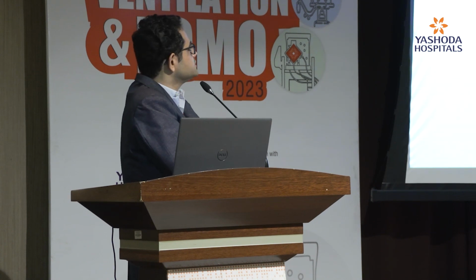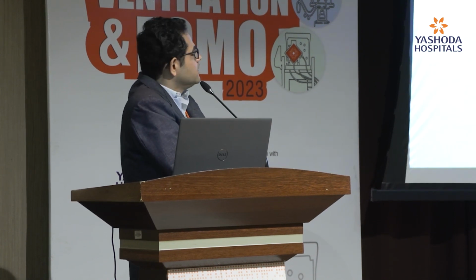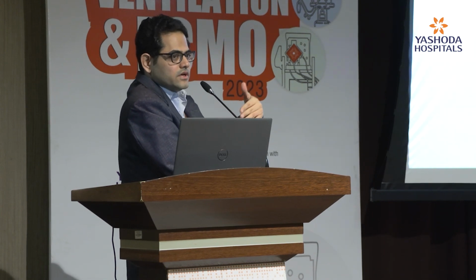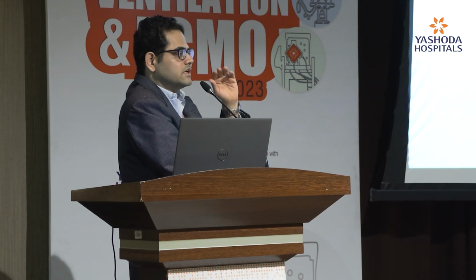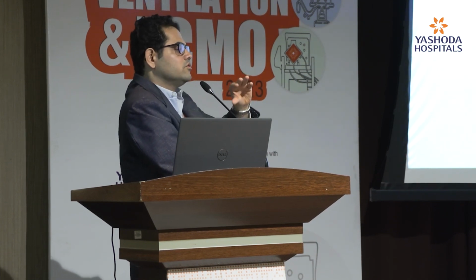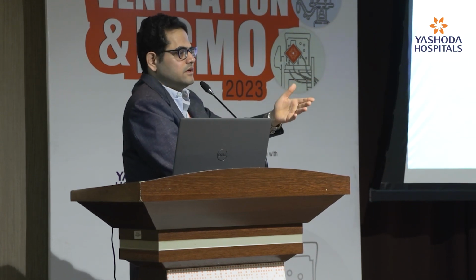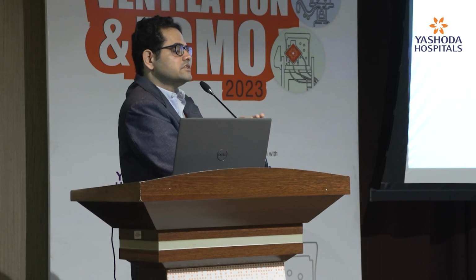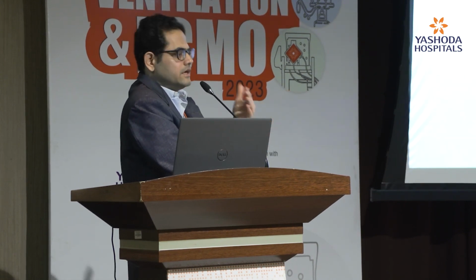It is a synchronized intermittent mandatory ventilation. Okay. So this is also one of the weaning modes. Not very commonly used, but the concept behind it is that when the patient is getting better, why not keep certain mandatory breaths and certain breaths which the patient can take. So certain mandatory breaths are supported by the ventilator, okay, and certain breaths the patient can take.